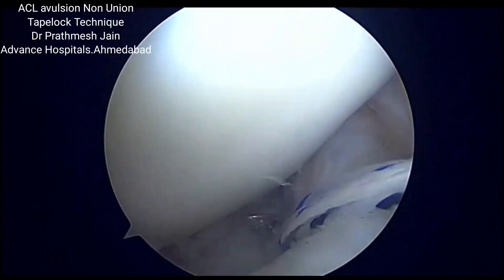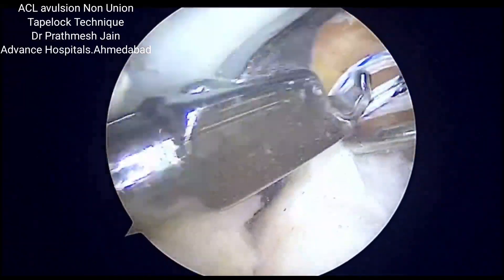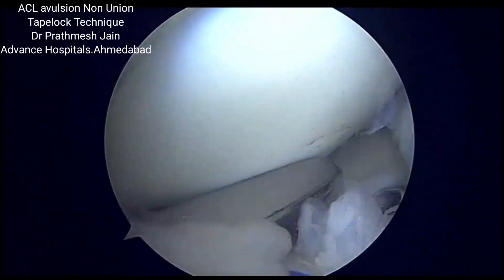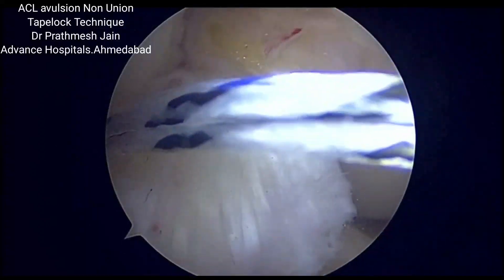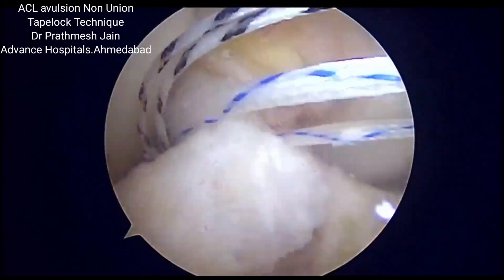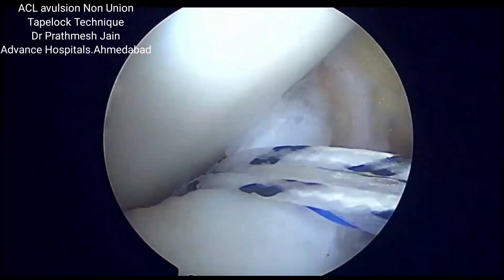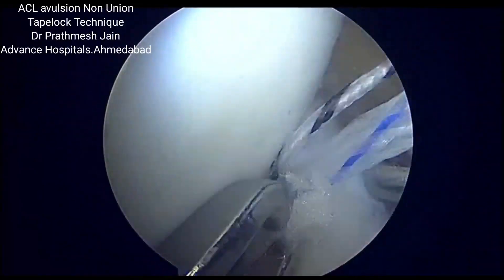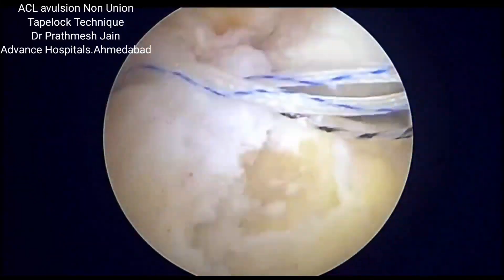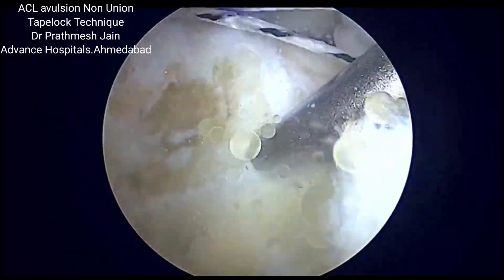After that, with the use of shuttling devices, we will be passing the tapes and the fiber wire. We pass one of the tapes through the stump and one of the wires through the stump. Once we are done with that, the fragment is in our hold. If needed, we can make an accessory portal for ease.